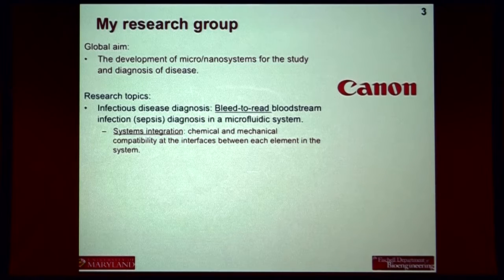I'll mention where Canon came into this. They have developed a system that does microfluidic PCR for genetic disease diagnostics. And they said, okay, here's a platform. How can you modify it such that instead of doing human genetic diseases, we can do bacterial infection diagnosis based on the bacterial genome? Fortunately, people have looked at this problem before us, and the primers to use are already out there. But ultimately, how you interpret the results plays into that, and how the human genome interferes with the reaction plays a part in that. But the sequences are fortunately well understood already.